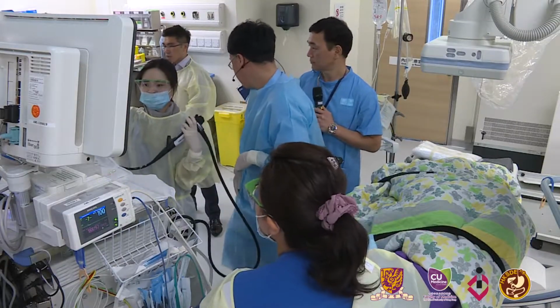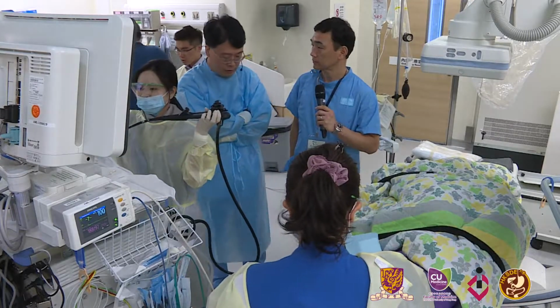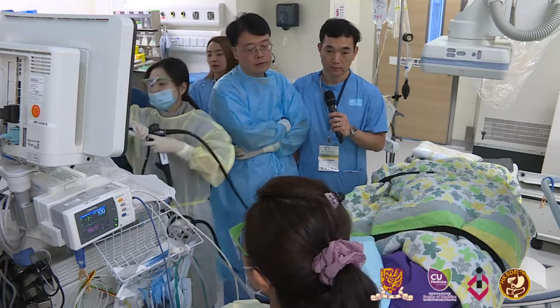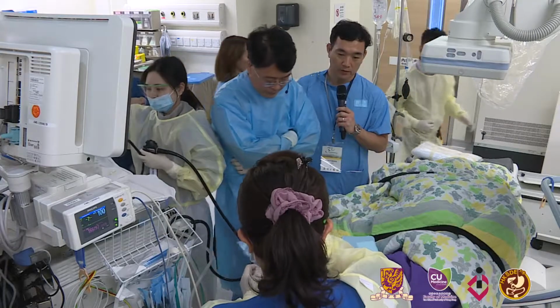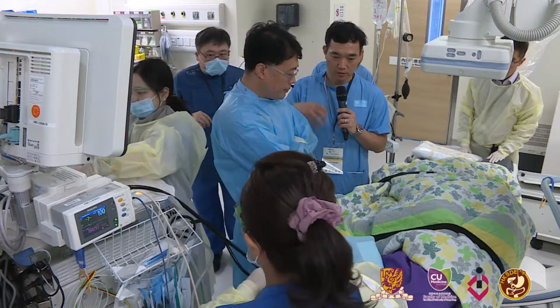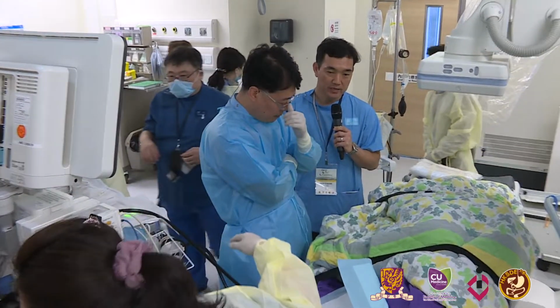Do they have the full thickness resection device in Hong Kong? It's not approved in the U.S. for the upper GI tract, though I know Moen was talking about his experience using it for this. I contribute to the multi-center study as well. The full thickness device you can introduce to the stomach with the current format. The main issue is the size limitation.